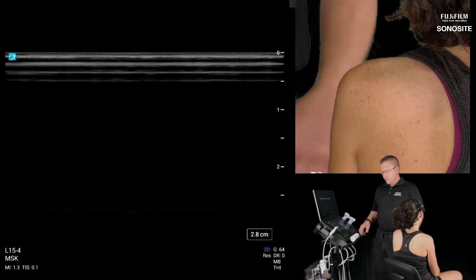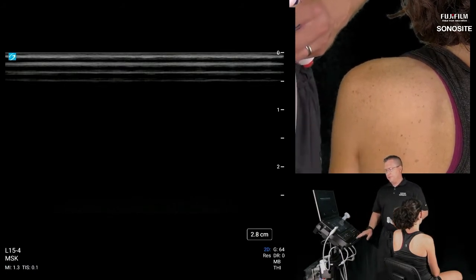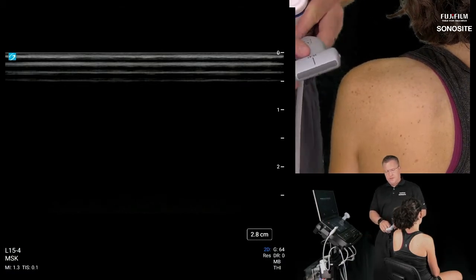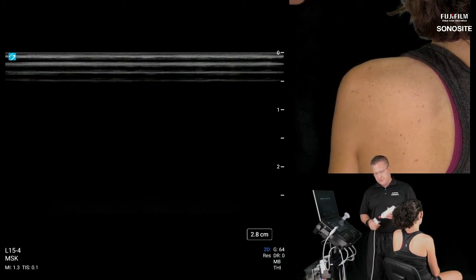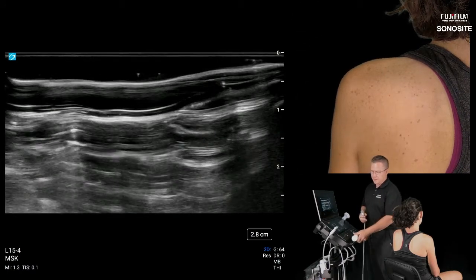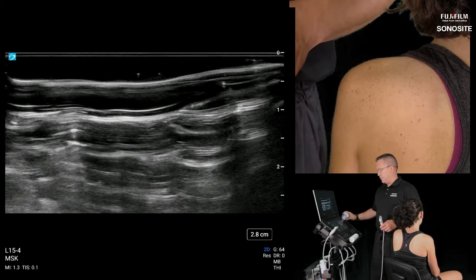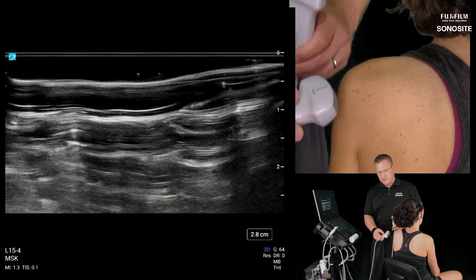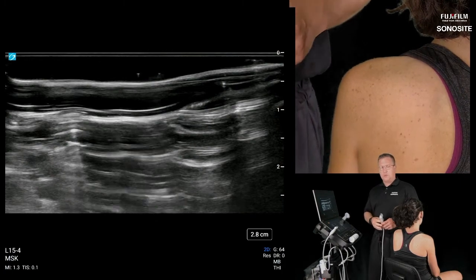All right, so now we'll move to the live scan, and today we're going to be scanning on the newly released Sonosite PX. I'll be starting with the L15 to 4 megahertz transducer, which is the overall general musculoskeletal exam probe. And then for some of your patients who get a little bit larger than my shoulder, you may want to opt for the curvilinear for the posterior shoulder, especially in injections. This is a curved 5 to 1 megahertz transducer. So if there's time at the end, we will switch over to that.